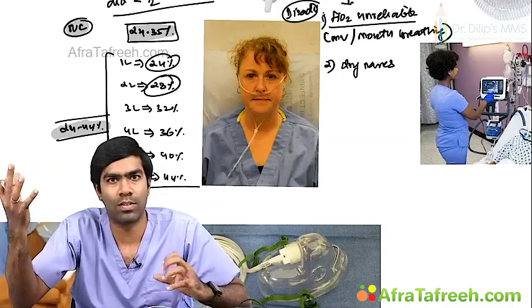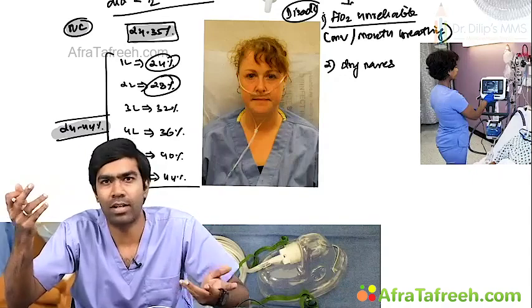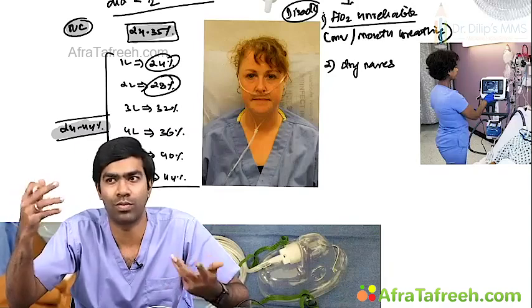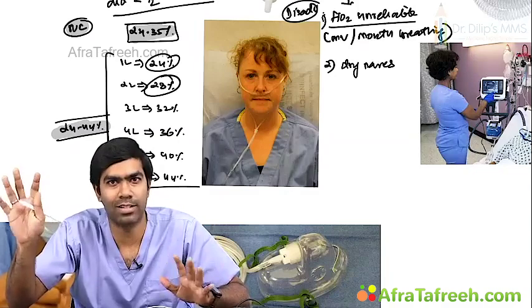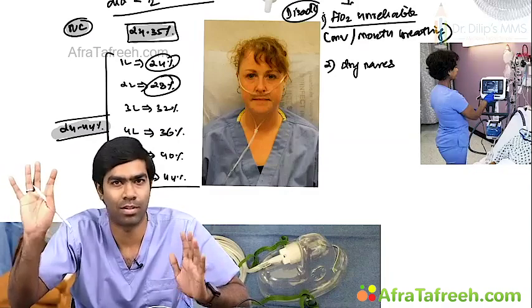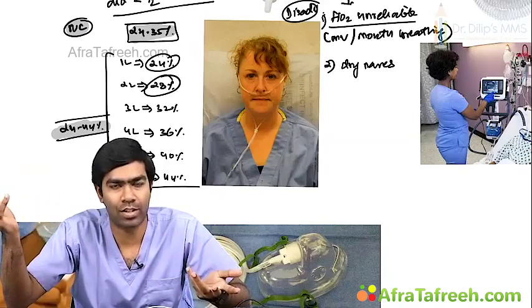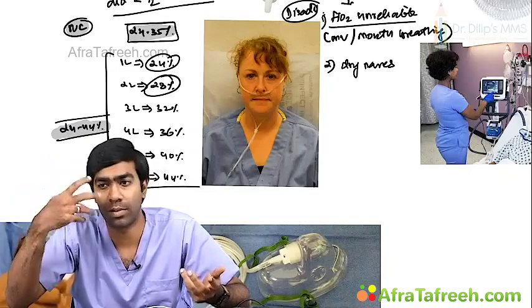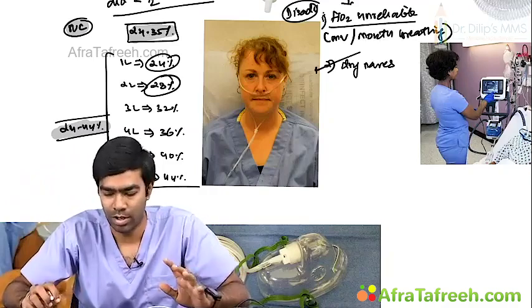Oxygen is always bubbling through that. So does it humidify well or not? The answer is definitely no. It's a very bad humidifier. But still we are using it because we have one principle in the hospital: something is better than nothing. So it does some humidification, but not good humidification. If you use these nasal prongs for 6 to 8 hours, you're going to end up with dryness. Sometimes it may result in bleeding also. So you have to be careful. Dryness is one of the very important complications.